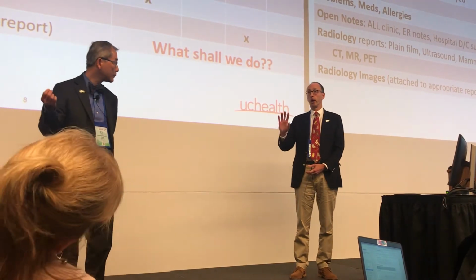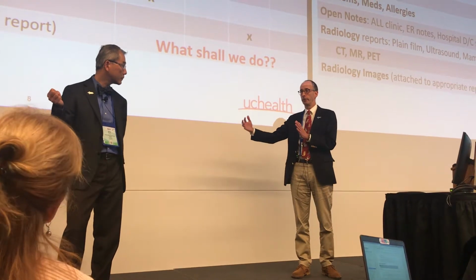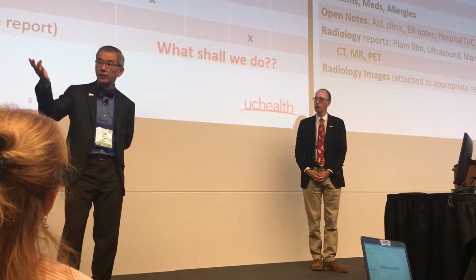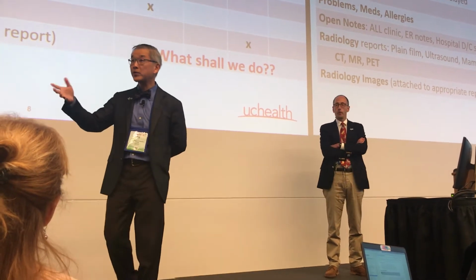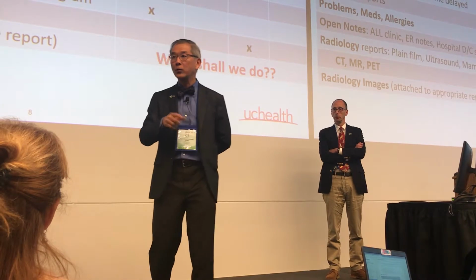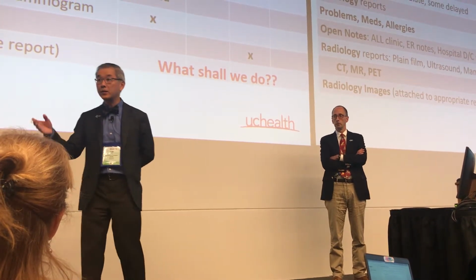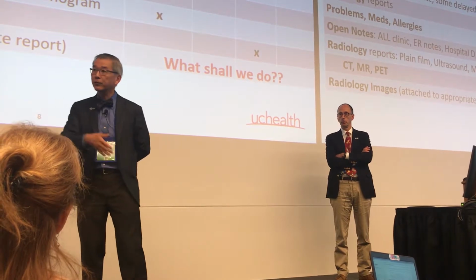I will say also, philosophically, I think this is a train that's moving and that patient advocates will insist on this, and at some point we will be forced. This was about 7-8 years ago when we first started doing PET scans, right? We wrote embargo rules for CT, MR. We didn't have to write a rule for a PET scan. So the first PET scan went through immediately, and we did that for a couple of months until an abnormal, multiple mets to the brain in the oncology service on a Friday.